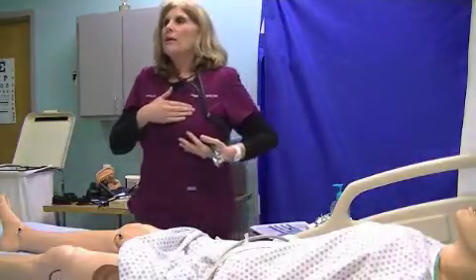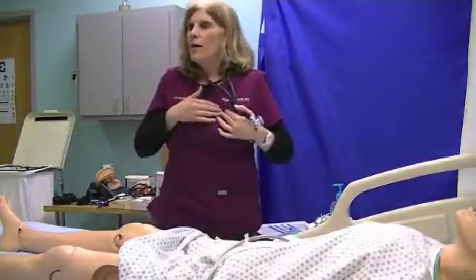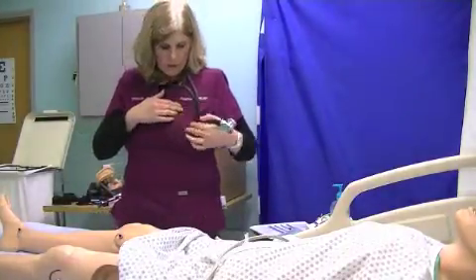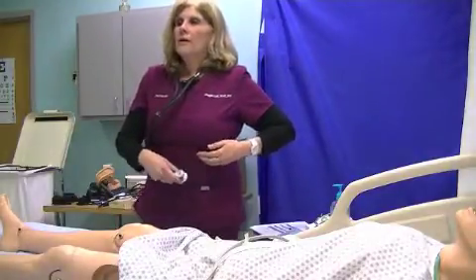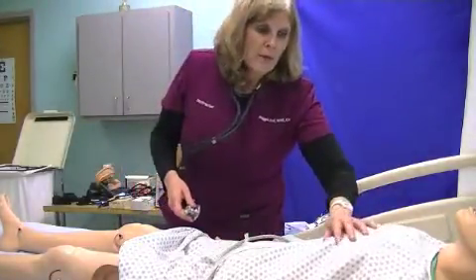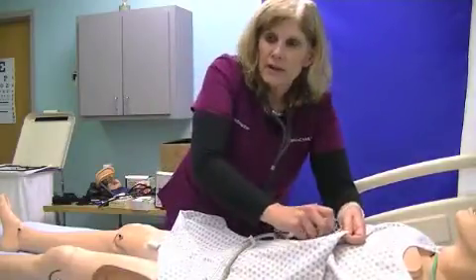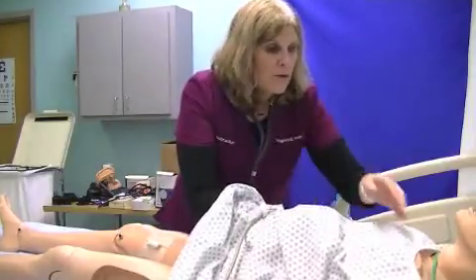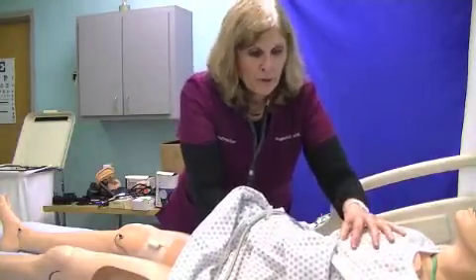Now, with men, you can always listen at the fifth intercostal space because they don't have much tissue, but with women you have a lot of breast tissue, so you have to go up underneath the breast, and if a person has a bra on, make sure you get way up underneath. On my patient, I would go up underneath the gown, because if you listen over the gown, you're going to hear scratching. So you always want to listen on the left side, fifth intercostal space, mid-clavicle line, and for females, underneath the breast.